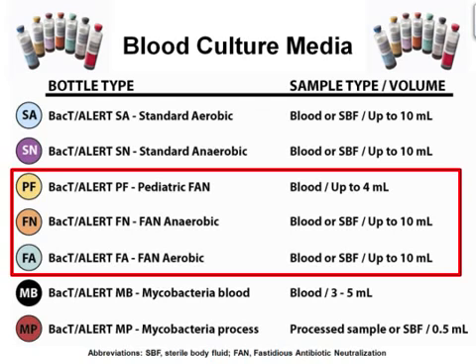The 7 types of media listed in this figure are the most common bacterial blood culture bottles. The standard aerobic and anaerobic bottles are most frequently used for blood culture. Each contain 40 milliliters of supplemented tryptic soy broth and can be dosed with up to 10 milliliters of sterile body fluid or blood. Like many other methods of pathogen detection, blood culture has its disadvantages.